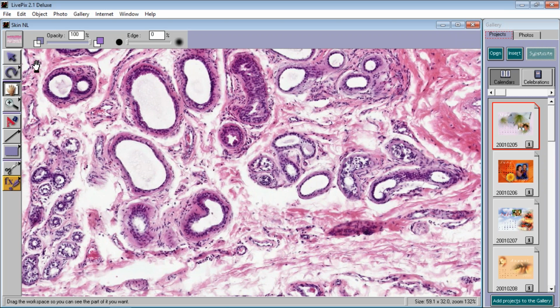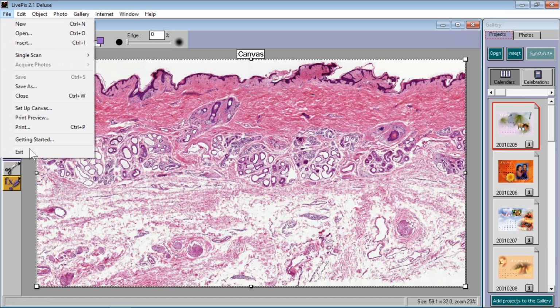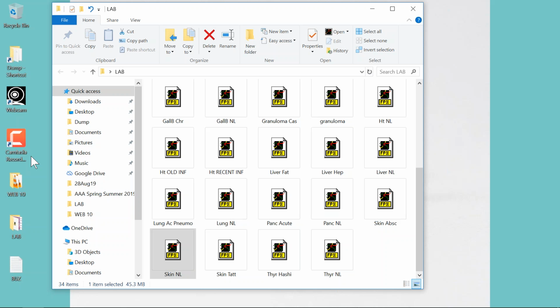So what? Remember, this is basic pathology we're learning. This is nothing fancy. So you've got skin, epidermis, dermis, sweat and sebaceous glands, and a little bit of fat underneath. Big deal. What am I going to show you now as a basic disease process of skin? When we get to skin, we're going to look at probably 30 or 40 different types of patterns. But let's take a look at this one, for example.